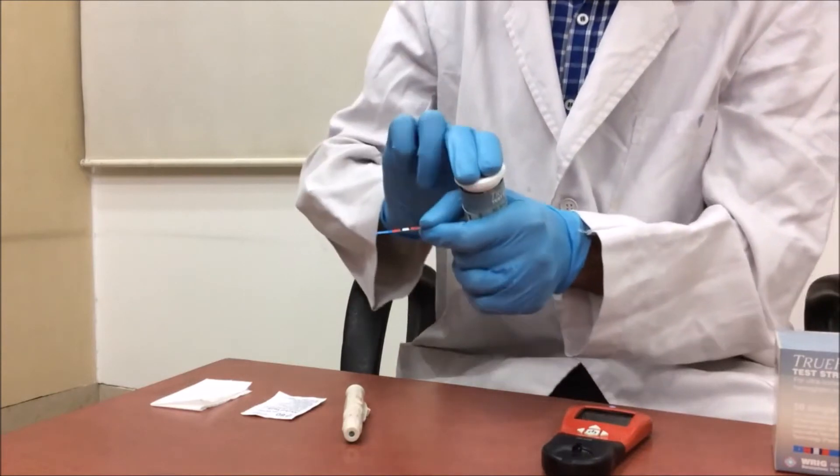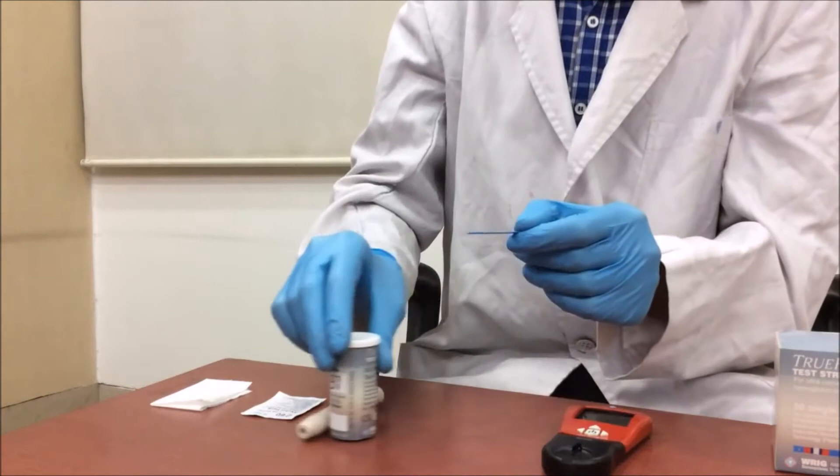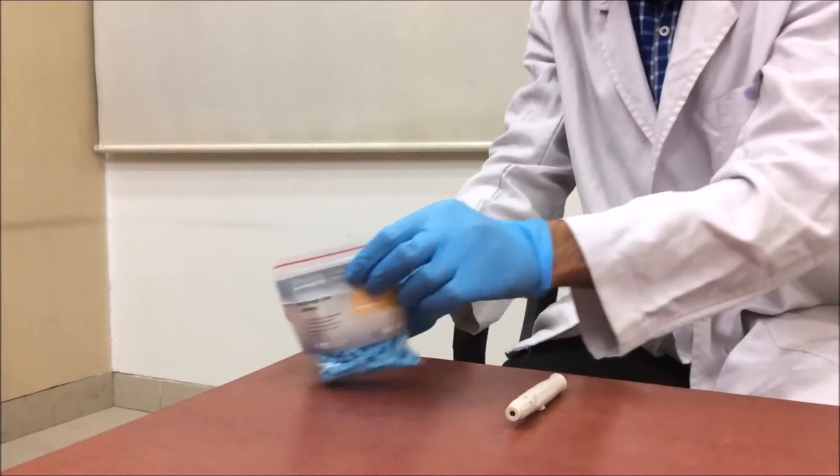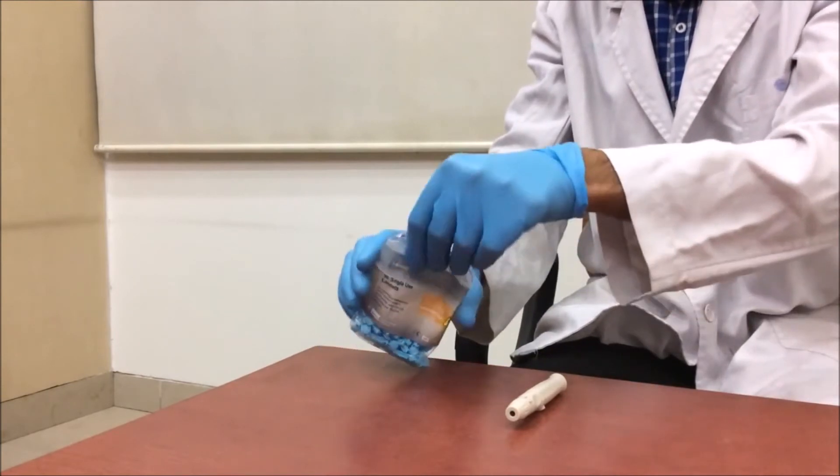Insert the strip in the test area. A blood drop blinks on the screen. Take one lancet from the pack of lancets.